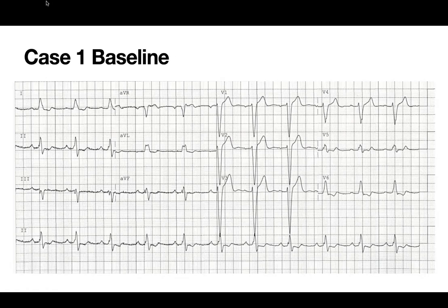So I'm going to show the first 6 or 7 cases, the pre and post, showing that if you have a left bundle branch block as the initial ECG at baseline, like these were all cases with patients who came in with left bundle branch block, syncope, intermittent AV block, and EFs between, let's say, 40 and 60, for example. And the ones who have the Strauss criteria with a nice double notch in AVL or V6, but here, for example, you see in AVL, QRS between 140 and 160, you can get some of the narrowest QRSs after the left bundle branch area pacing.